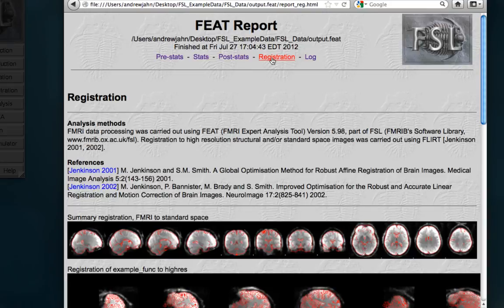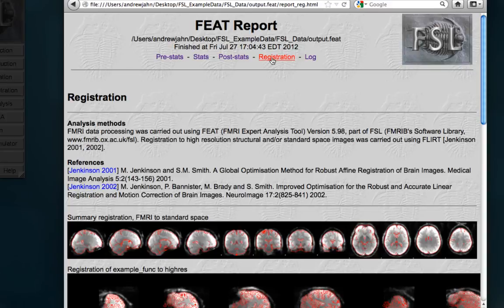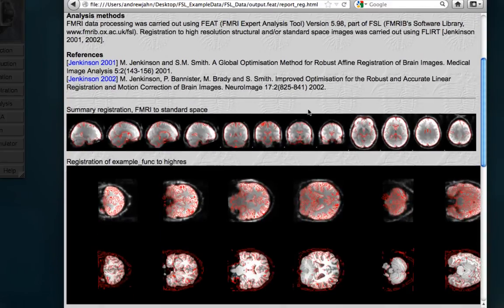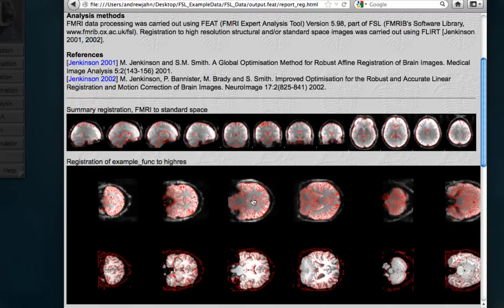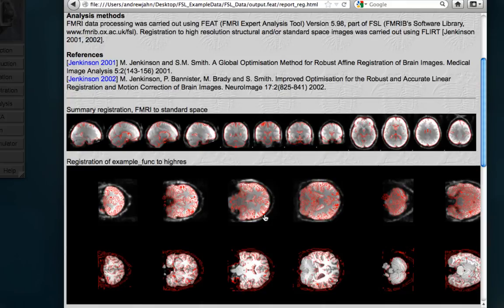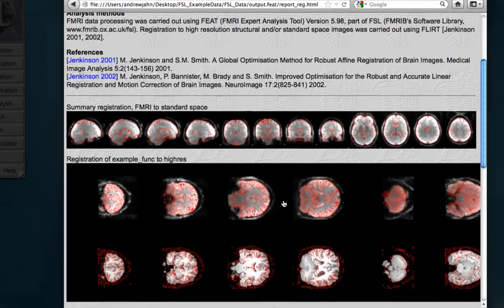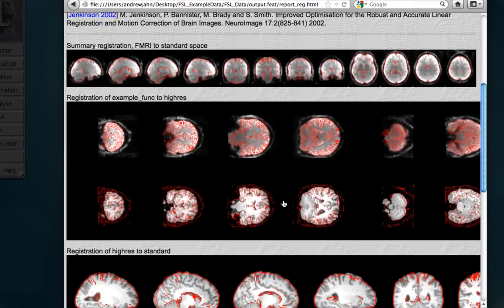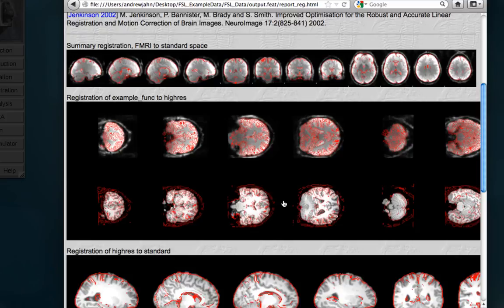Lastly, look at the registration to see how good of a job it did, both co-registering the functionals to the anatomical, and then warping it to a standardized space. So, first thing you see are these red lines here. And don't worry about the orientation, just make sure it looks reasonable. These red lines will try to roughly outline where the gray and white matter boundaries are, and where the grooves of the sulci and gyri are, and also important structures like the ventricles. Now, it's worth pointing out here that it's really important to make sure that it did a good job aligning the internal structures.